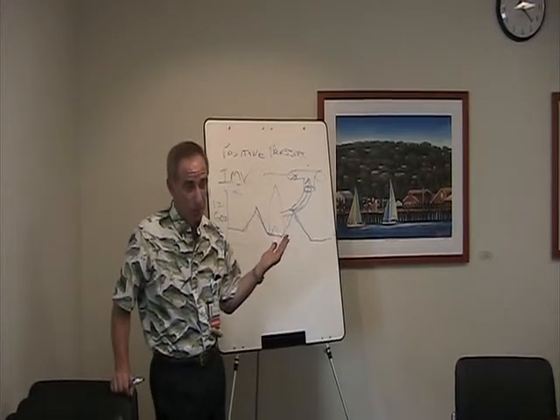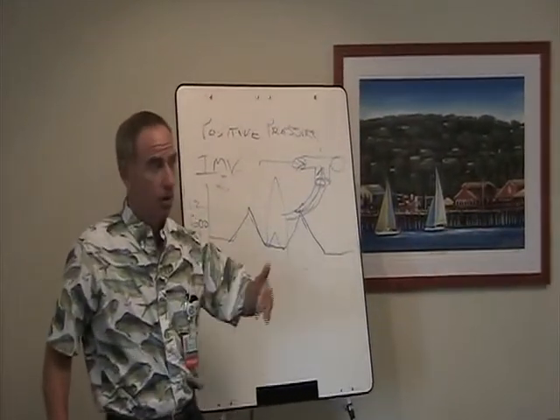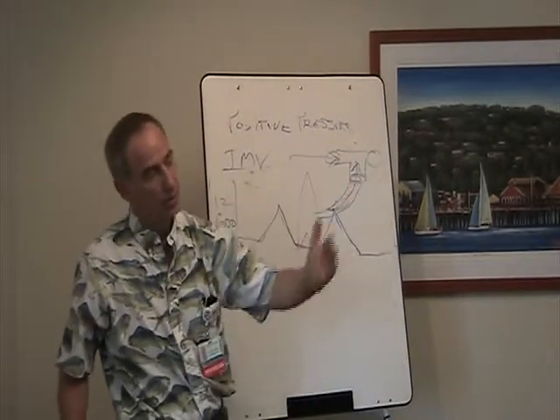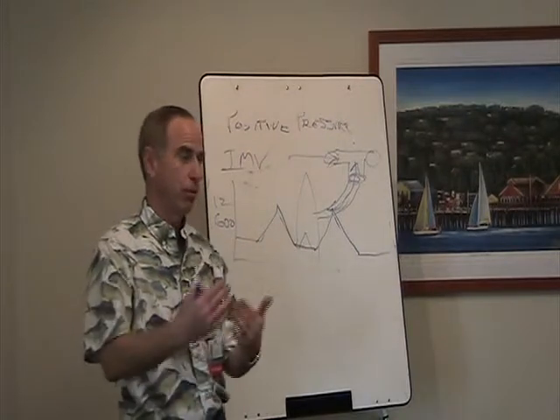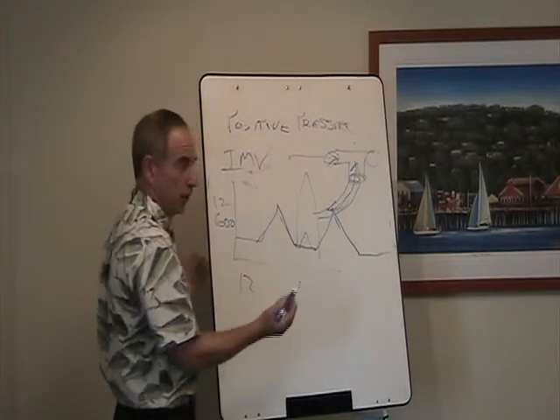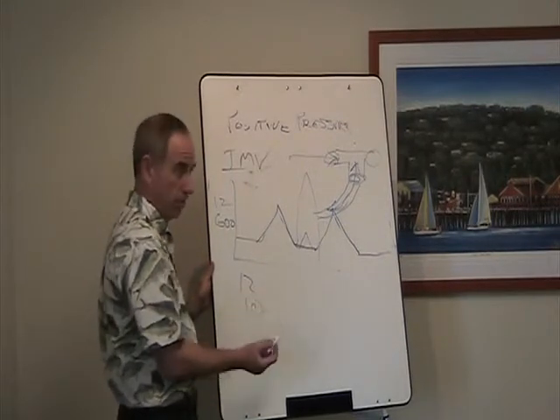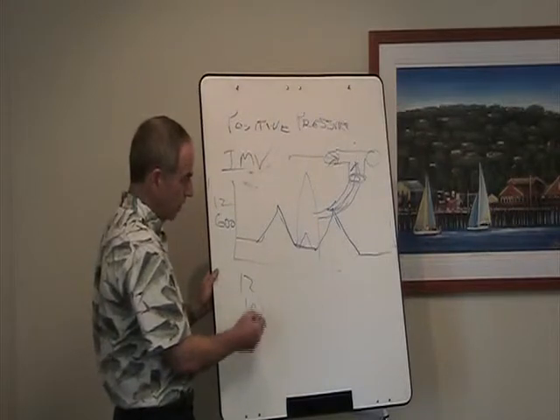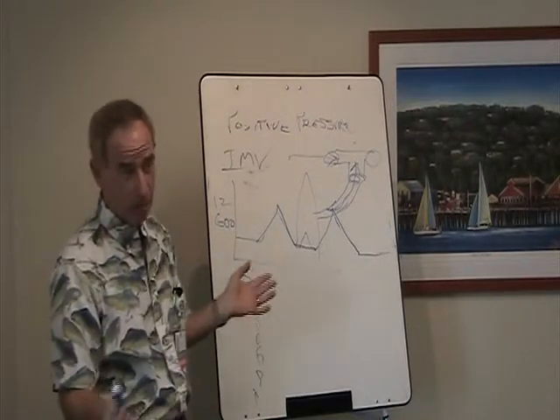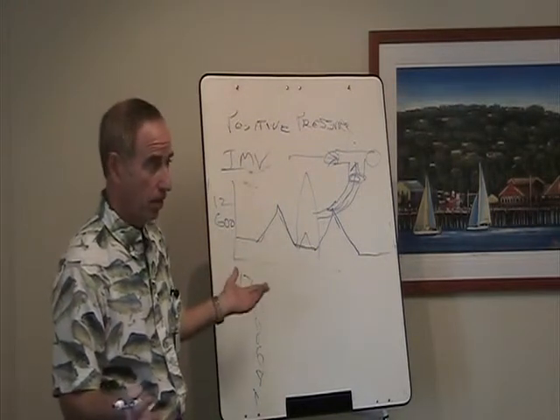So people thought, well, maybe that's not the best way to wean somebody from mechanical ventilation. Maybe we should have a more gradual process where we support them partially and gradually remove that support. Initially support them completely and then gradually work it so that they improve. So that's why IMV was invented. And the idea was you would start them out on a rate of 12 or 15 or whatever it was. And when you thought the patient was ready to start weaning from the ventilator, you would step down the rate. You'd go from 12 to 10 to 8 to 6 to 4 to maybe 2. And then you could either extubate them or do a T-piece at that point. And this process could take anywhere from days to weeks, depending on the patient.